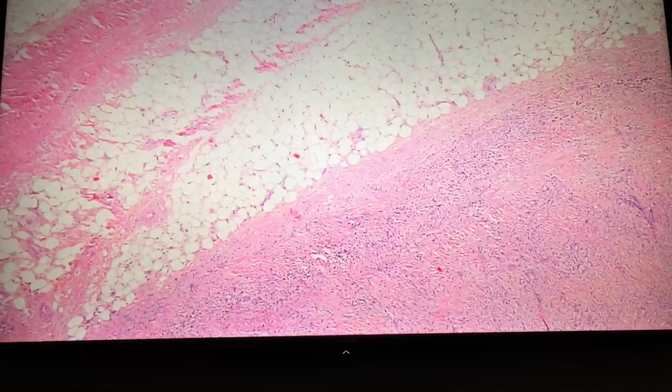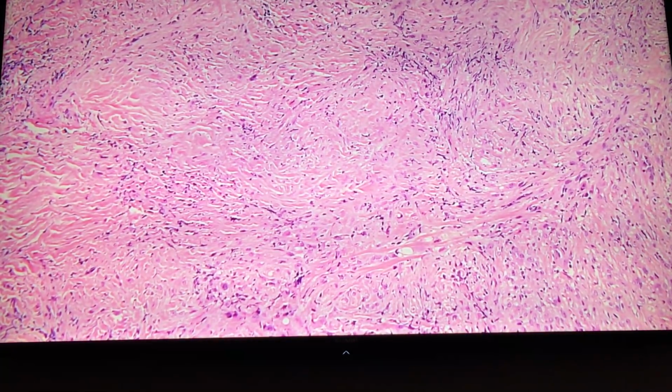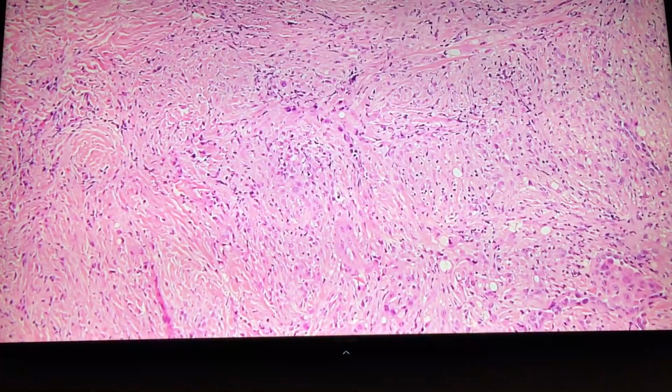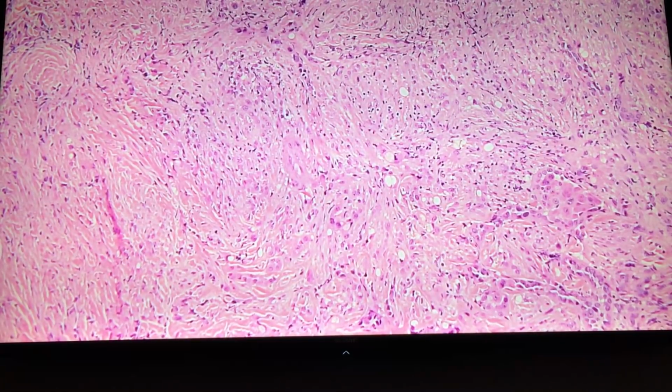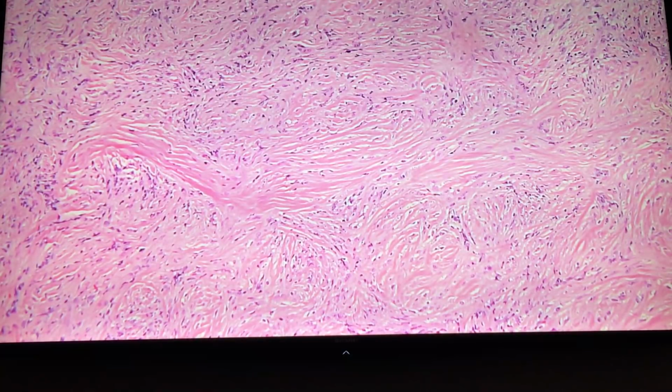Okay, so show them the lesion, Aaron. And then when you're sure you're in the lesion, just leave it there for a few seconds so everybody can wrap their head around what's going on. We'll need higher mag. Yeah, I would leave it here for a few seconds, just like the mesothelioma we saw before. And move it around a bit. No, yeah, leave it here for a second.